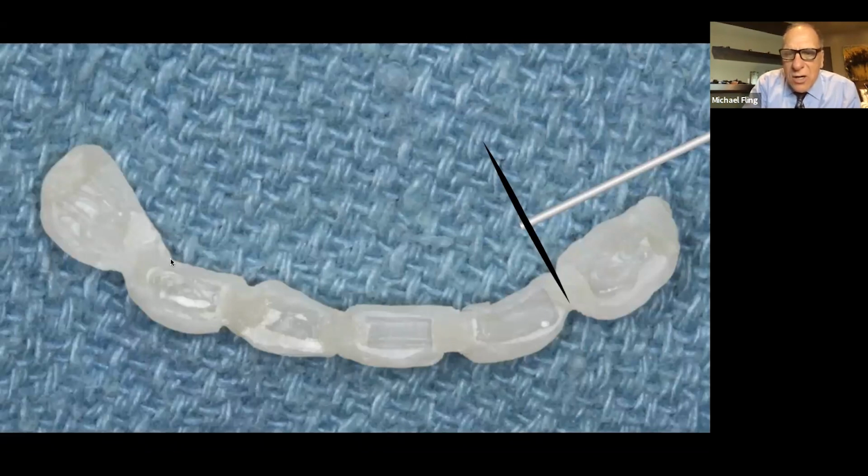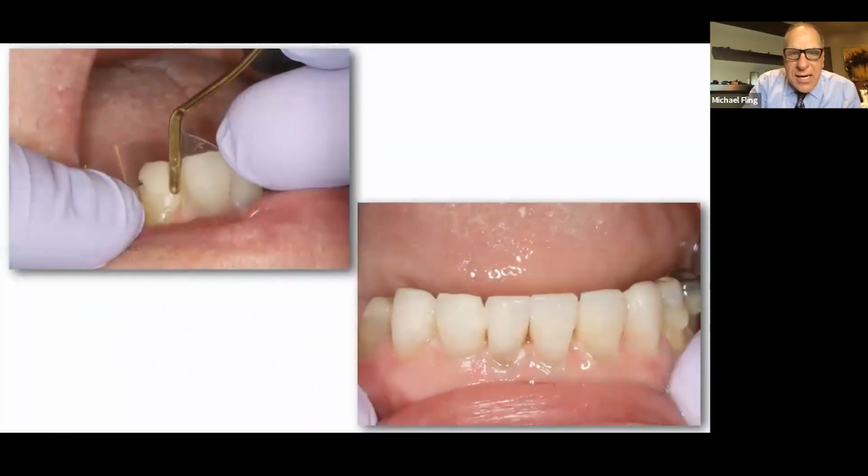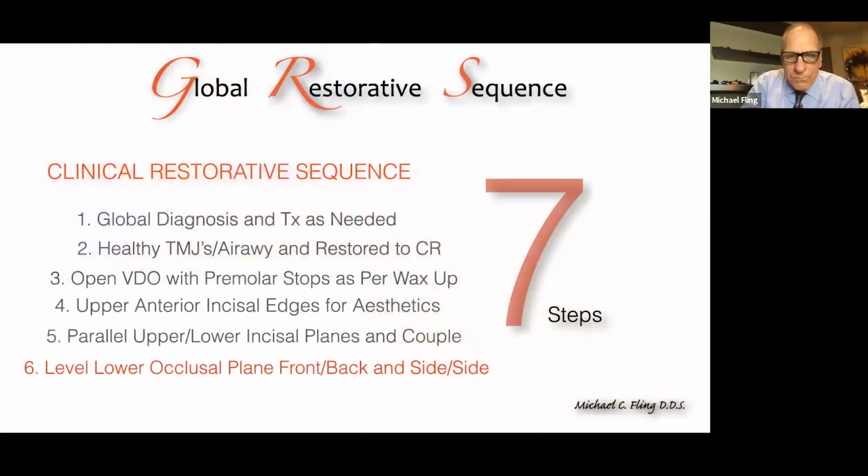He went in and started to section these. And here you see him putting them in one by one. Okay? He's packing the composite with the packable composite. He'll get rid of the excess. He'll go back with flowable. And this was his first attempt to do it. And you know what? That's a pretty darn good result. And he gets them all polished up. These were individual where you can floss between them and off you go.